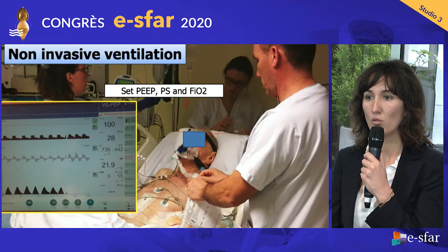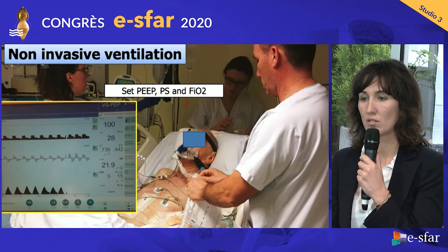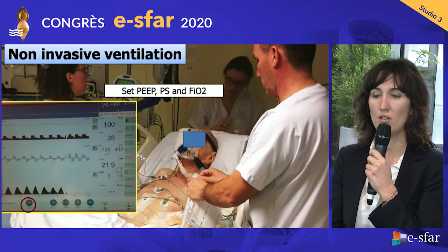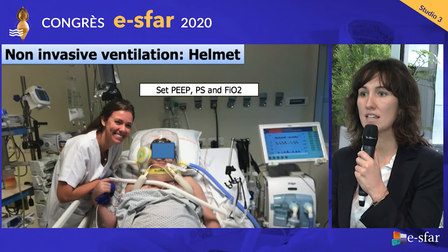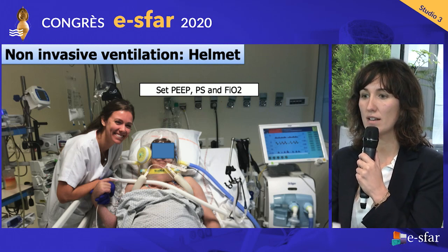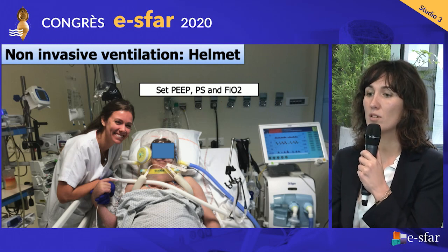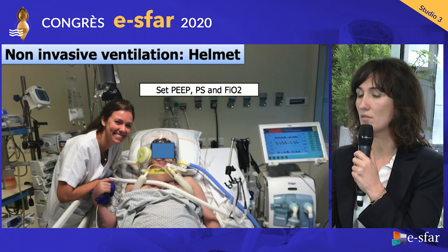If you set also a pressure support, then you have non-invasive ventilation. So the PEEP is set like a 5, you can see on the screen, a pressure support of 10, and then a FiO2. Another type of interface is the helmet mask, which also allows non-invasive ventilation. The helmet mask is sometimes more comfortable and allows you to vary the interface applied, between classic facial mask, total face mask, and also helmet.